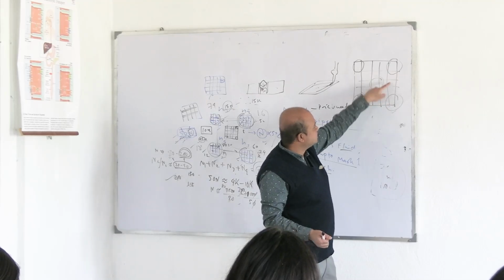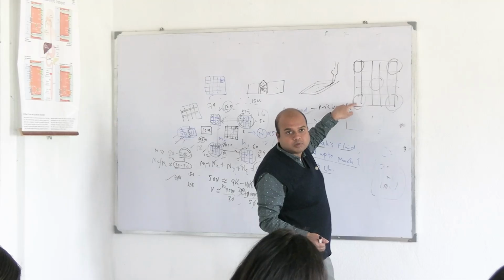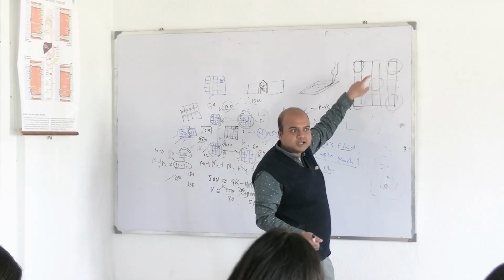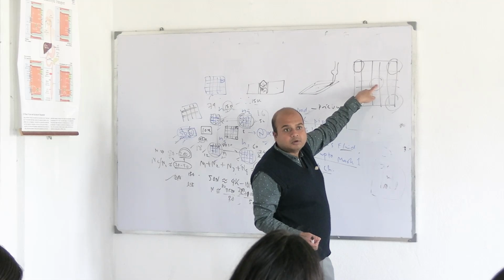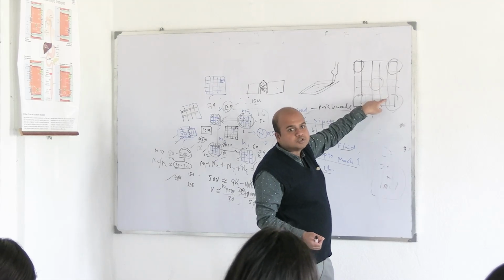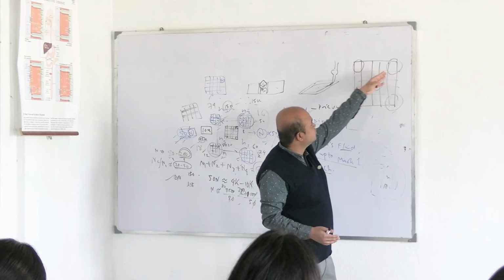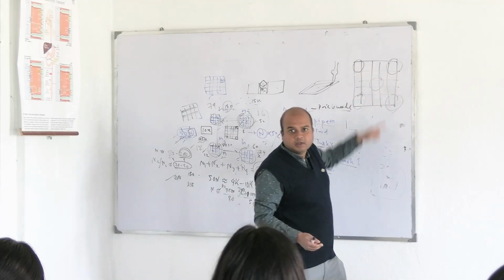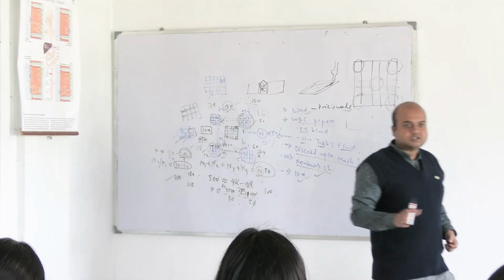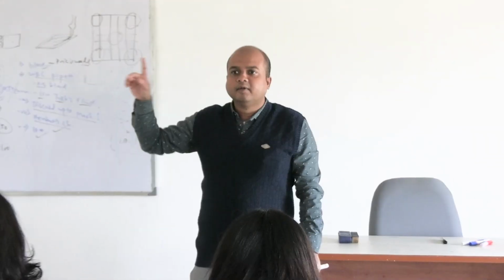Move down 3 squares, leaving 3, the fourth one, again leaving 3, the fourth one to the left after counting, and the central one is found by going 2 up and 2 towards the middle. If you start from any other square, you have to modify it accordingly. If you start with this and end with this, you have to go 2 down and 2 left, but I think for the beginners it is better to do what is taught conventionally. So start with the left upper one.